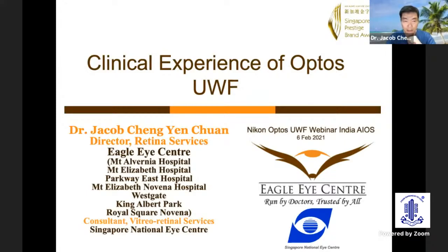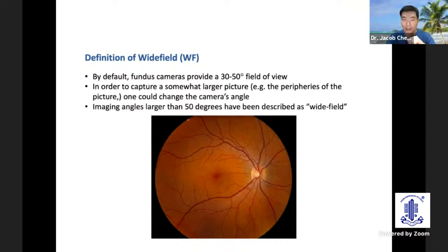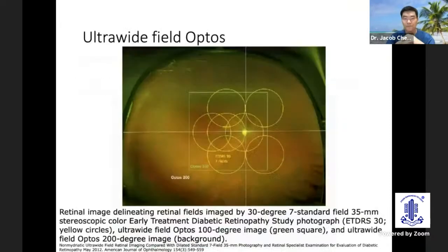My talk this evening will be on a clinical experience of Optos. Definition of wide field: the earlier speaker has mentioned, by default, a fundus camera provides a 30 to 50 degrees field of view. To really enlarge this, we have to change the traditional camera angle. Image angles larger than 50 degrees would be labeled as wide field. Definition of ultra-wide field has not really been accurately defined. Some have defined it as more than 100, but some, gaining popularity, define it as more than 150 degrees of view.